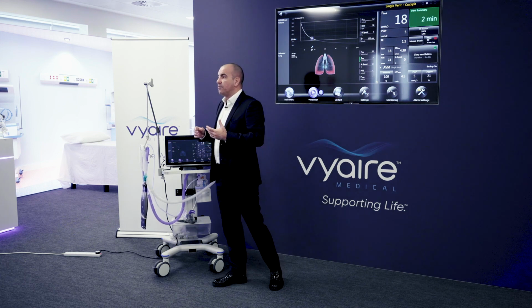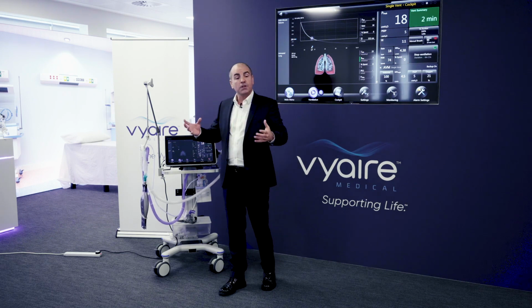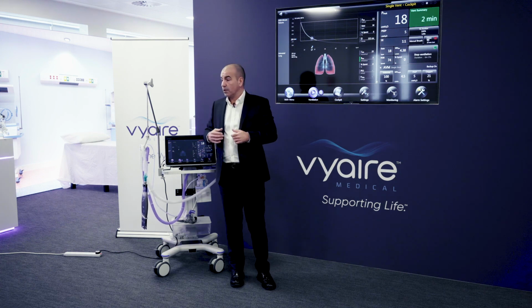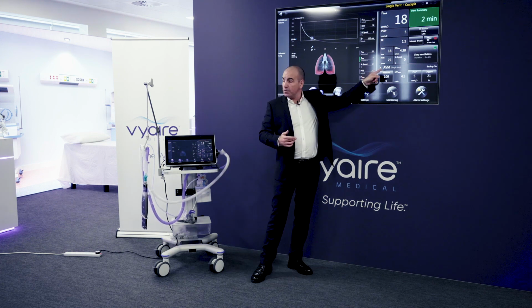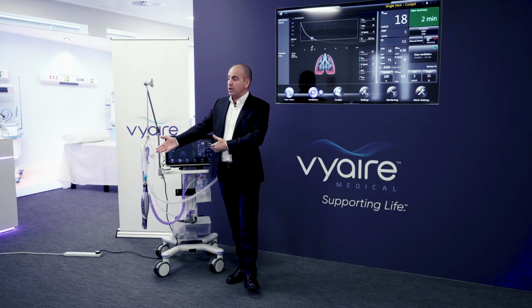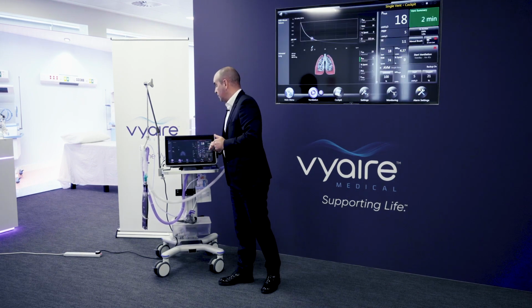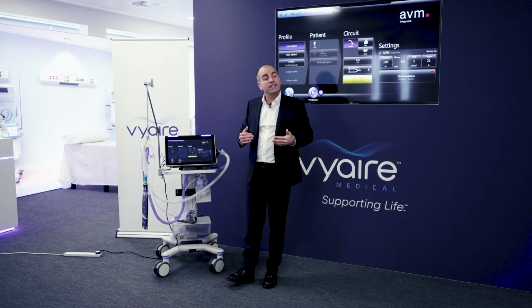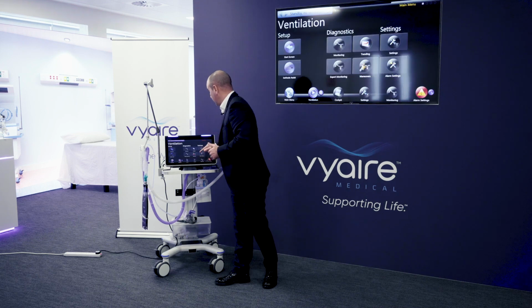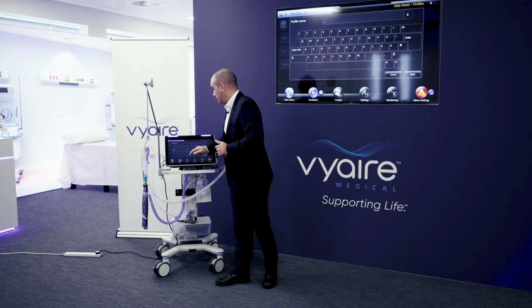In terms of the busy ICU that we referred to before, you might have several doctors on the department, and they might have different schools of thought. So for instance, Dr. Joan might like this mode and these settings. So when the patient is admitted under the care of Dr. Joan or Dr. Dodds, you can go here and you can save it as a profile. You can save up to 20 profiles. So you can standardize your approach to care. So we'll go into here, we'll just slide along, and we'll save this as Dr.